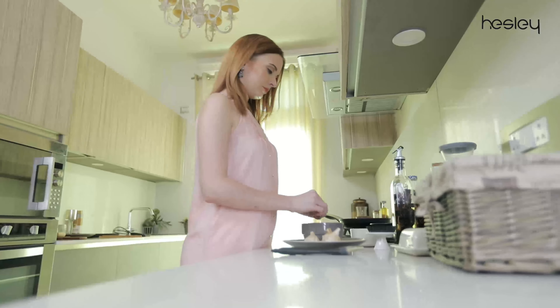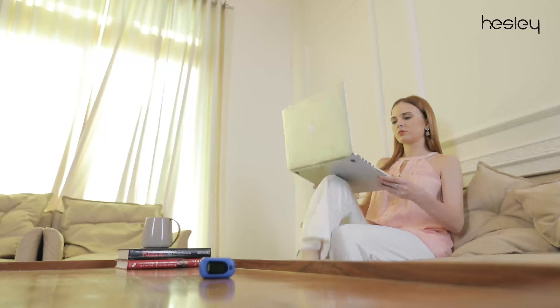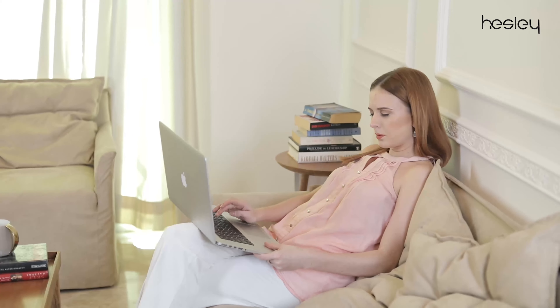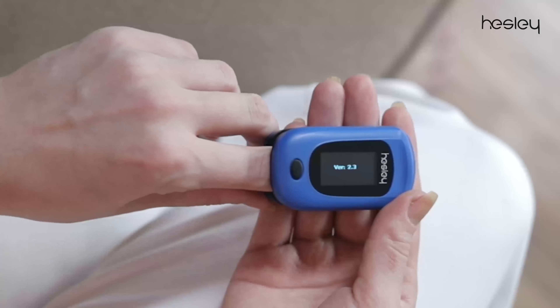Managing a home can be very stressful at times, and when you have to manage both home and work at the same time, the stress just doubles up. So if you ever feel uncomfortable due to overstress, you can easily check your oxygen levels and pulse rate with Hesley's PC60B1 professional fingertip oximeter.